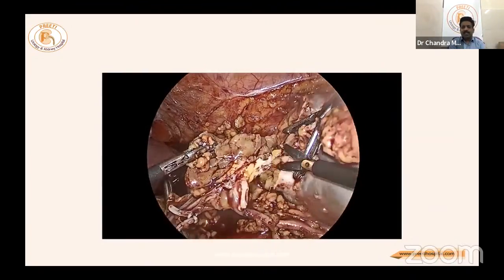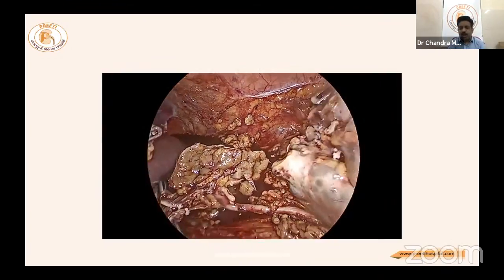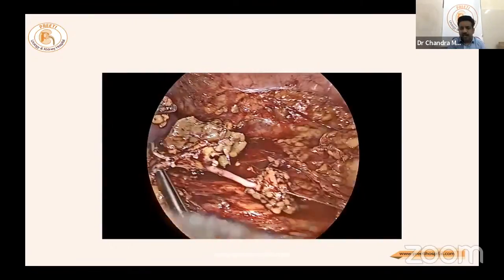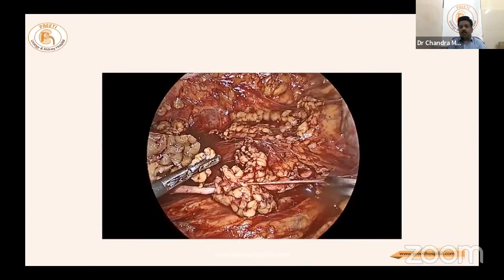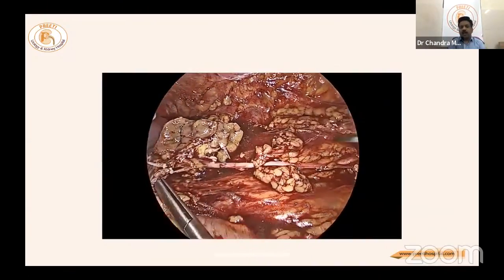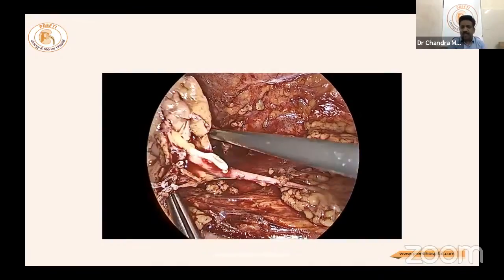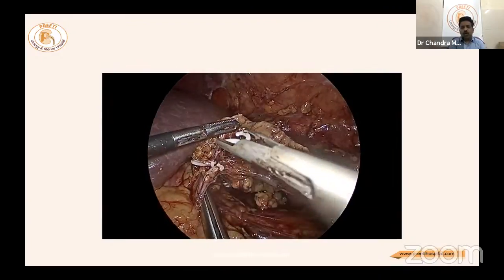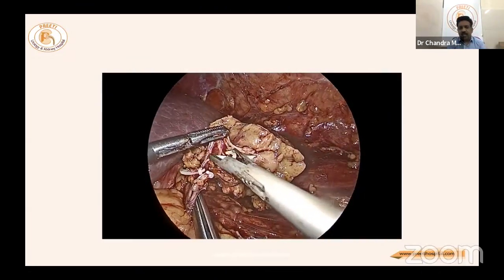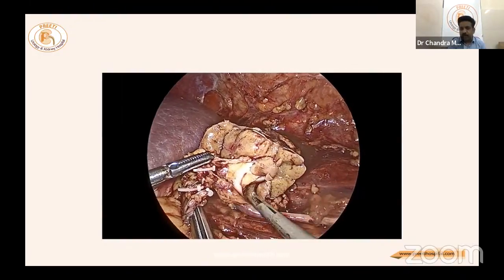The remaining kidney appears very small and there may be little point in saving it. Even with adequate precautions, the ureter appears slightly denuded in the upper part, which can happen in hemi nephrectomy. One person must hold the specimen while the freely hanging vessels are clipped — this is the advantage of hemi nephrectomy.